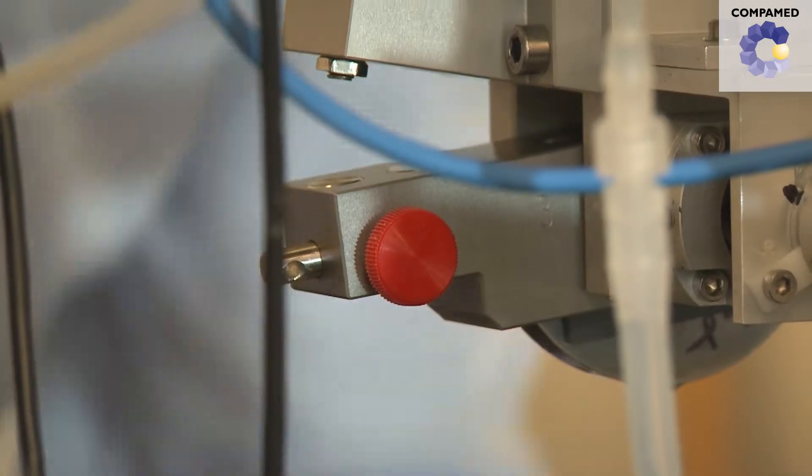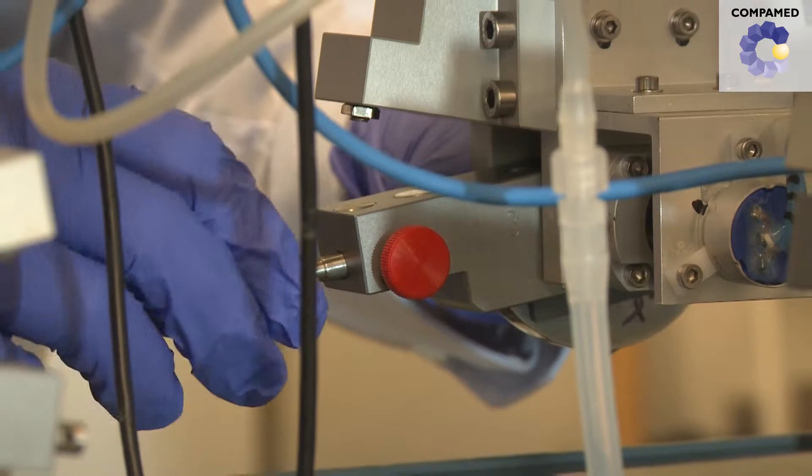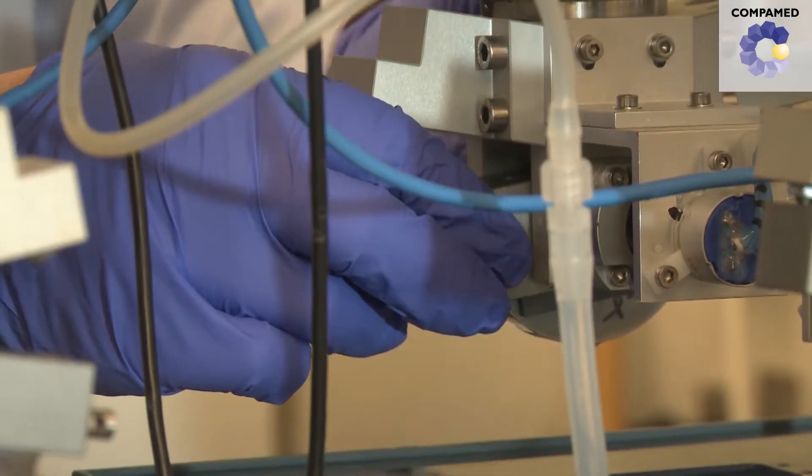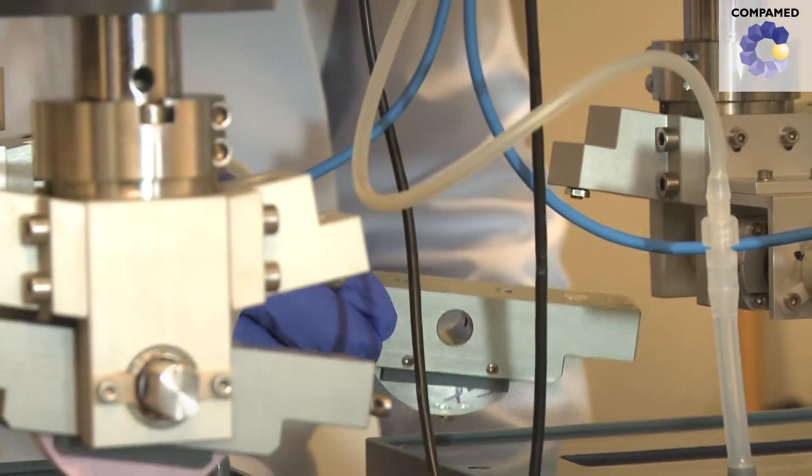Permanent knee joint damage can put a lot of stress on patients. This can be alleviated with prosthetics. Long-lasting ceramic prosthetics prevent premature wear and therefore more surgery.